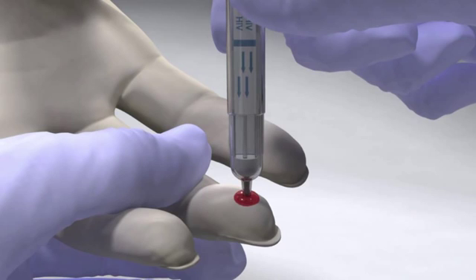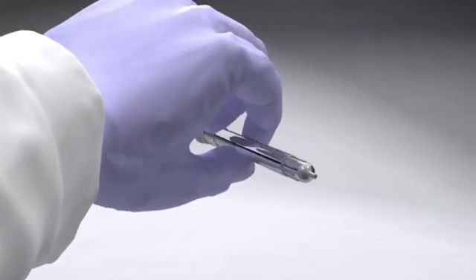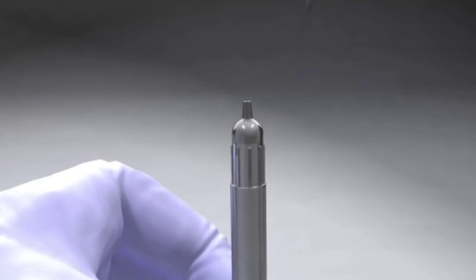If you're taking a sample from venous blood, serum, or plasma, invert the SureCheck device and pipette 2.5 microliters of specimen to the sampler tip.